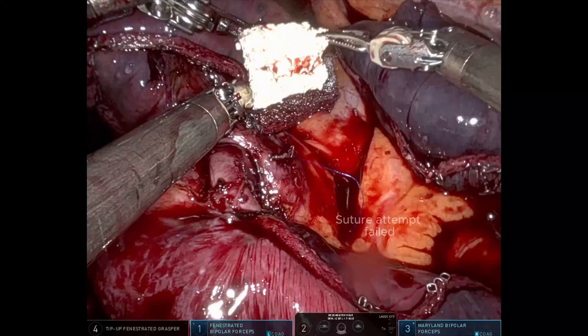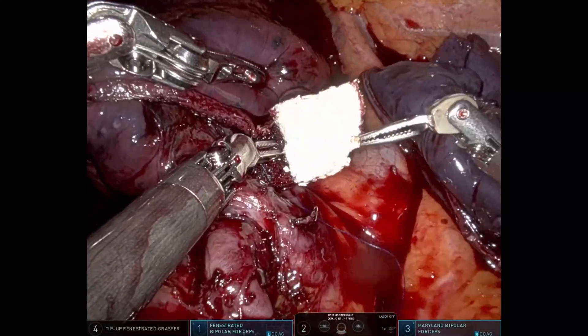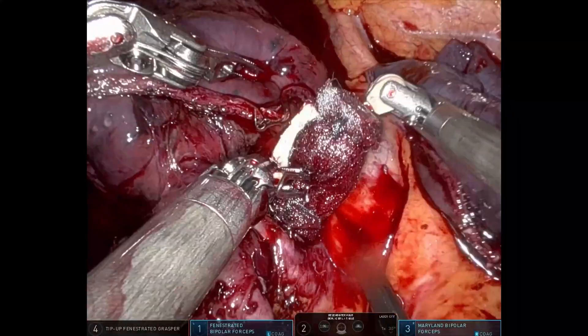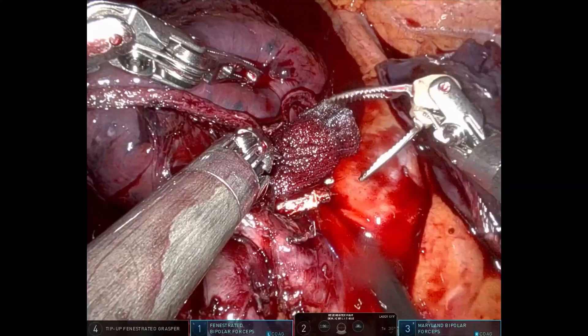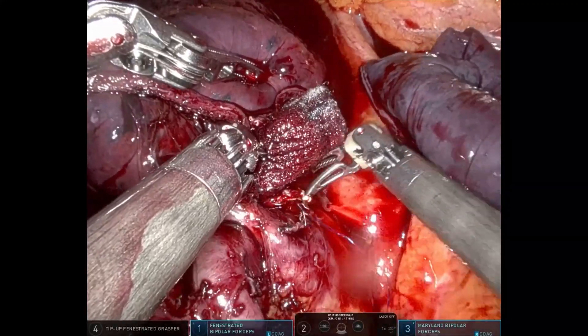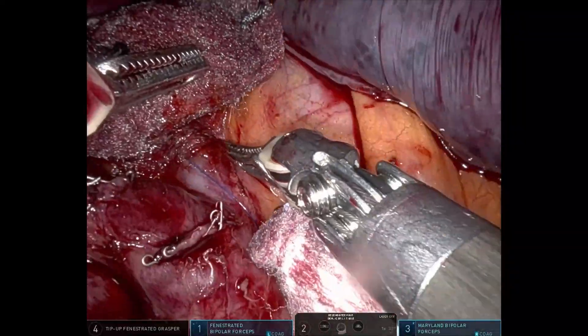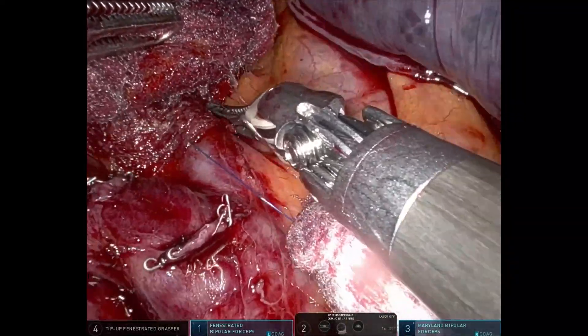Following our technique, initial compression is applied with gauze. Simultaneously, the second robotic arm is used to immediately apply the hemostatic patch over the injury site. A new gauze is then placed over the patch to ensure firm local compression. After a few minutes of compression, effective hemostasis is achieved.